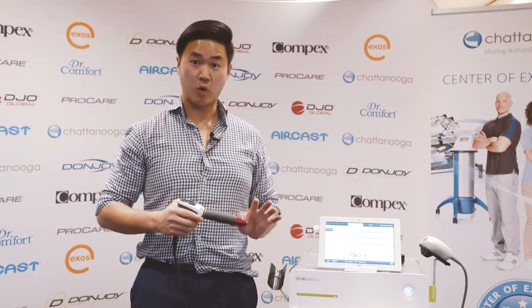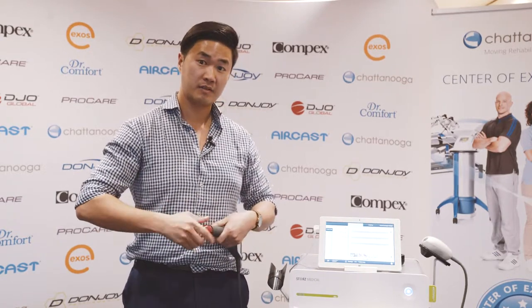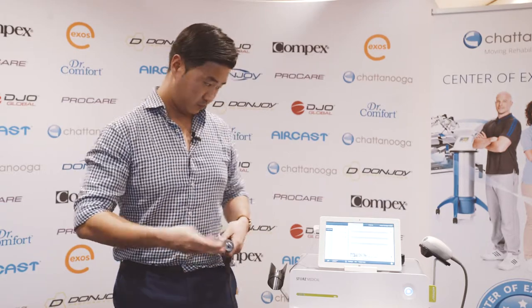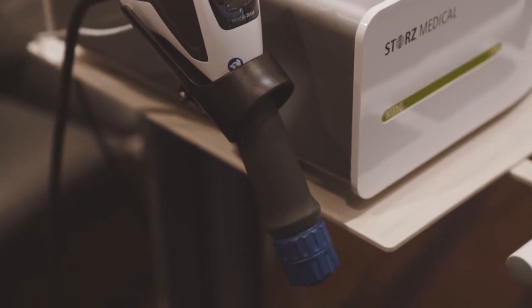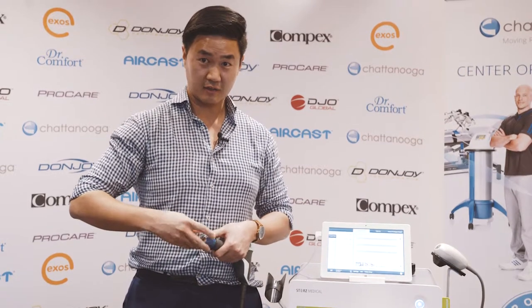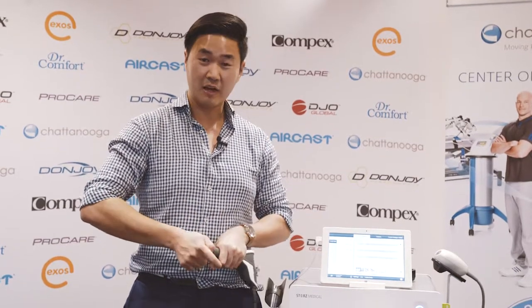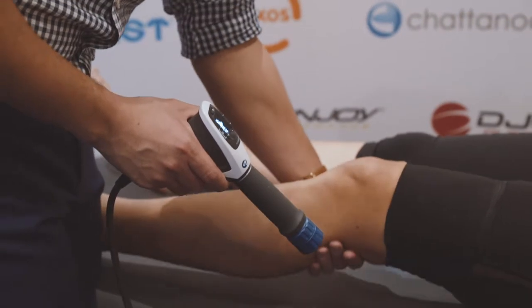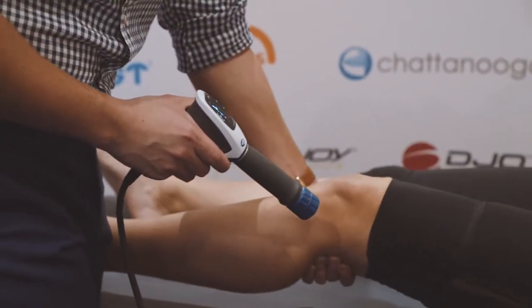Once the patient has become comfortable and accommodated to that intensity, I would change the headpiece to the 20mm. Note that the patellar tendon is most sensitive when palpated with the knee in neutral extension, so place a towel underneath the knee so it's slightly bent at about 15 to 20 degrees — that'll also reduce pain during treatment.